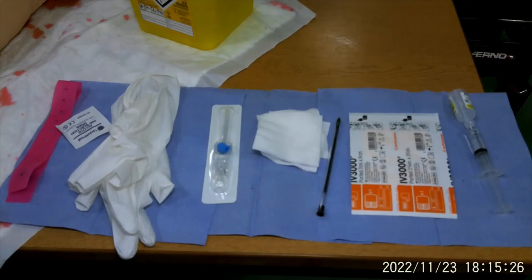Hi guys, so this is just an alternative for a cannulation OSCE. As you can see, I've prepared a sterile field to lay my equipment out, but this time the equipment is in a slightly different order to my previous video.